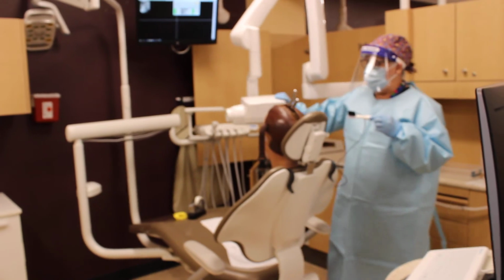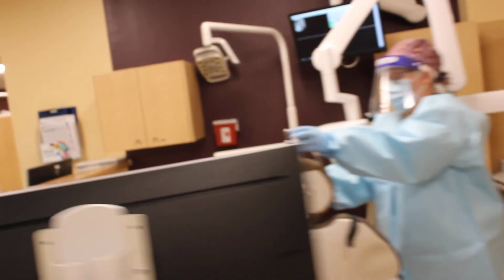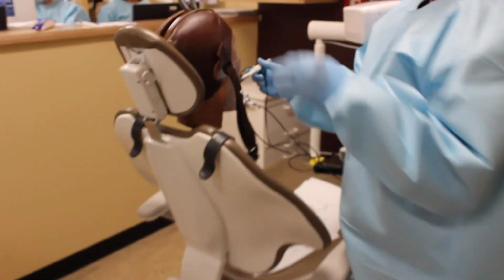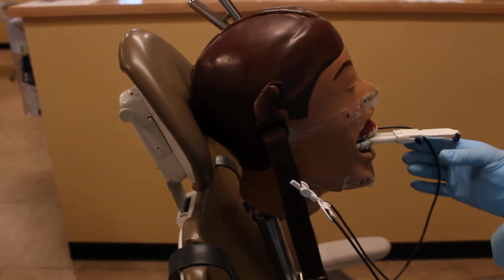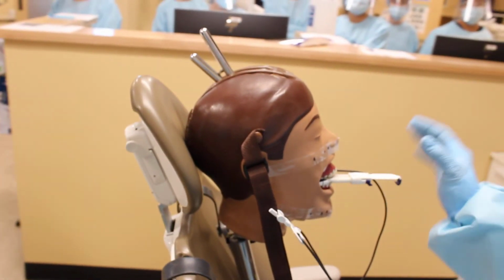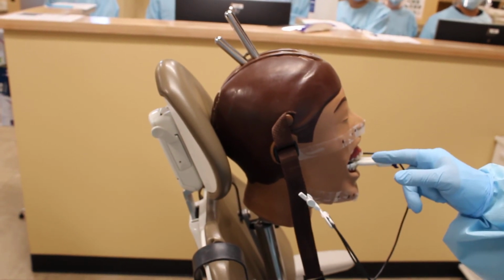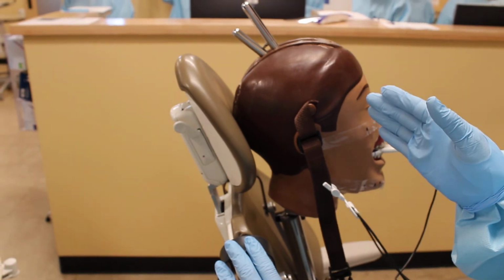So when I put this in the upper right, come over here, Ivan. Excuse me. The only thing visible when the patient closes is that blue line. And I know when it's in the upper right that the sensor is above and behind that.